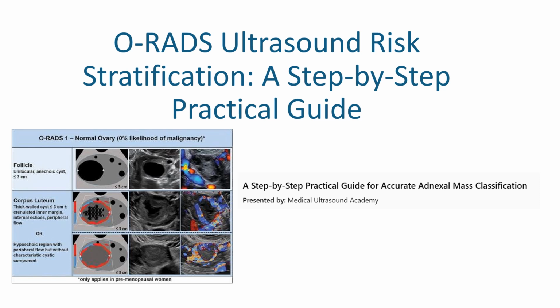Hi, just pause for a moment. Do you know the O-RADS? Or do we just do gynecological ultrasound scans without knowing the O-RADS? Let's talk.